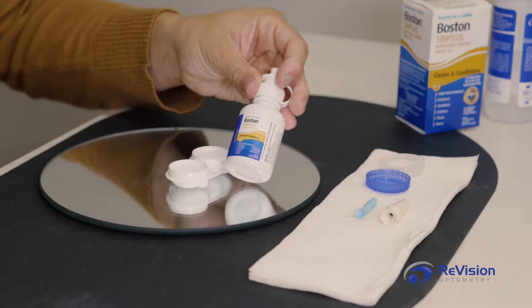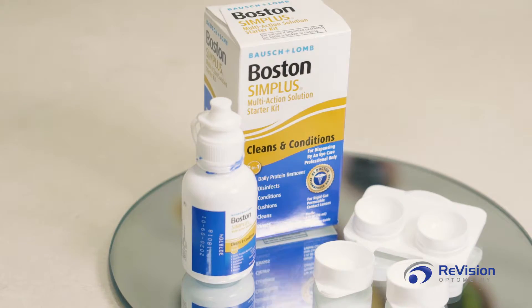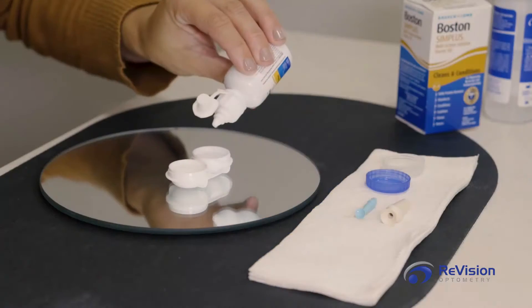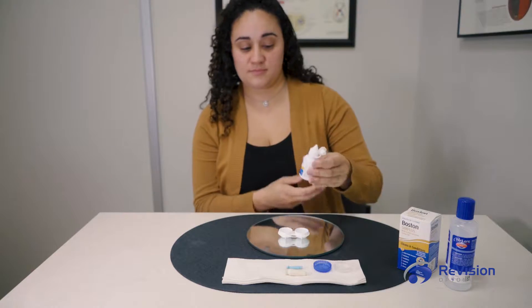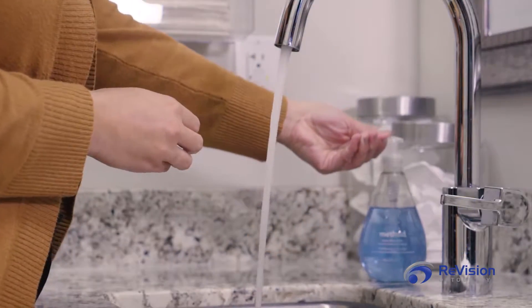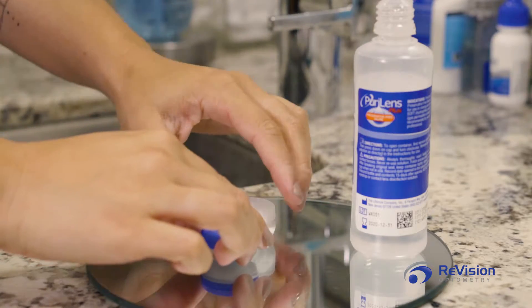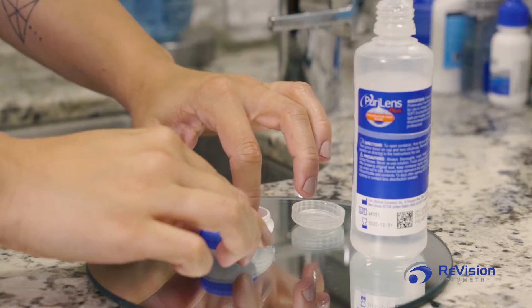At the end of the day, remove scleral lenses and store in a lens case with Boston Simplus Multi-Action Solution for at least four hours to clean and condition your lens. Prior to applying your lens, remember to wash your hands, rub the lens, and rinse off the Boston Simplus Solution with non-preserved saline.